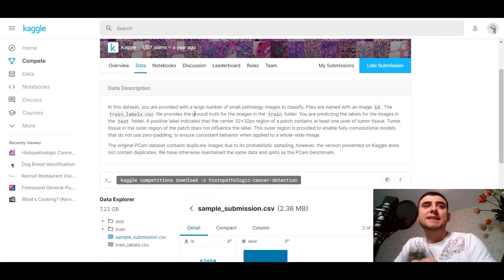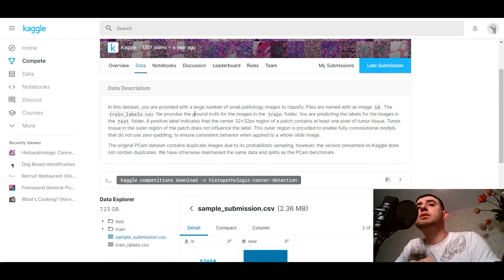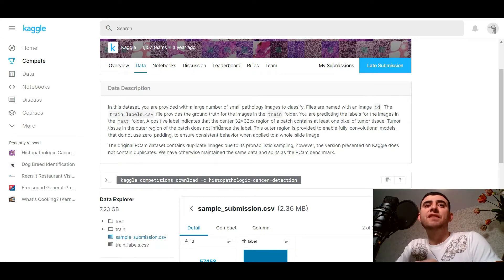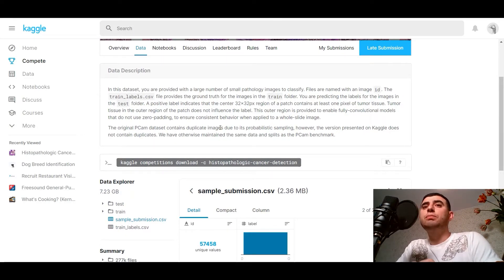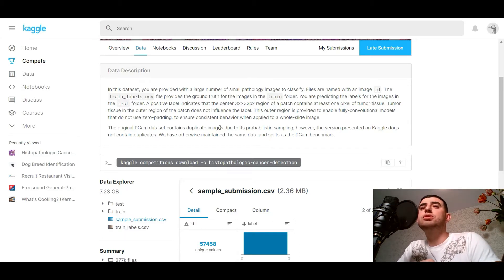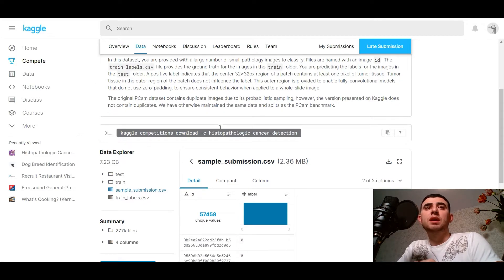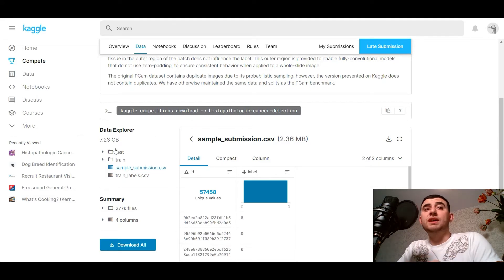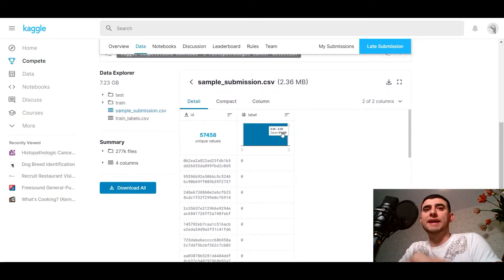Let's look inside the data. In this dataset you are provided with a large number of small pathology images to classify. Files are named with an image ID, and the train_labels CSV file provides the ground truth for the images in the train folder. You are predicting the labels for the images in the test folder. A positive label indicates that the center 32x32 pixel region of a patch contains at least one pixel of tumor tissue. Tumor tissue in the outer region of the patch doesn't influence the label. This outer region is provided to enable fully convolutional models that don't use zero padding. We've got test images, train images, and a sample submission CSV with labels and file names.